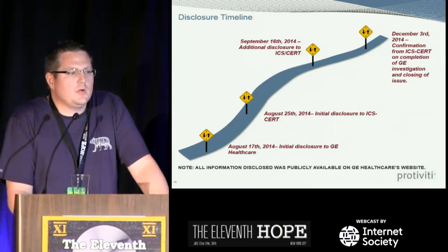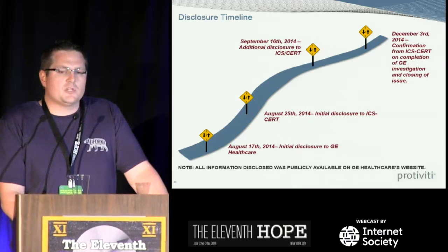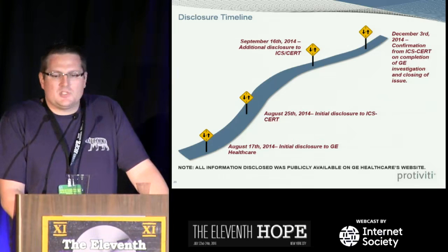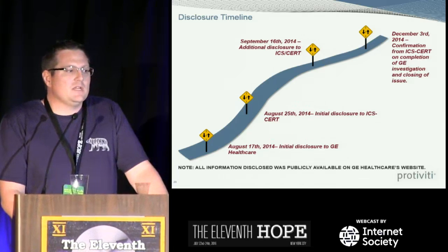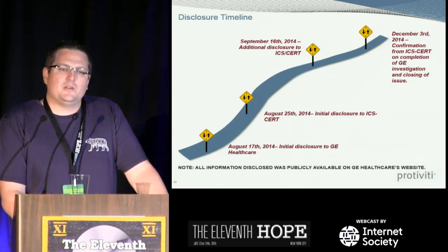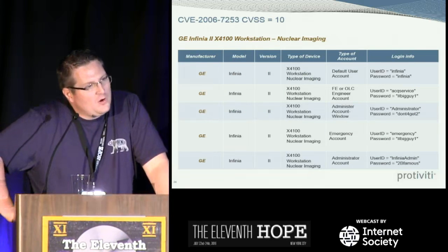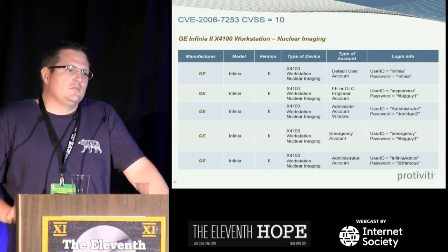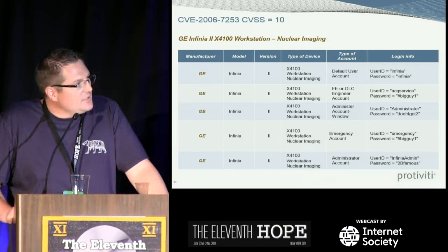And I think it's also very important to point out when we talk about this that although this is specific to GE, what I'm going to show you, this problem is not specific to GE. You see it across the industry. It's a systemic issue in healthcare and in medical devices. Historically, they were not designed or did not have security embedded during design or engineering. So here we go. I'm just going to do a subset, but overall, there's just over 30 CVEs for 150 sets of administrative remote credentials on systems. This will be followed, the CVE will start this, and then the CVSS score.